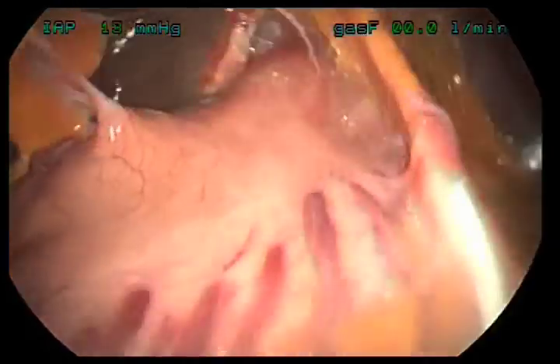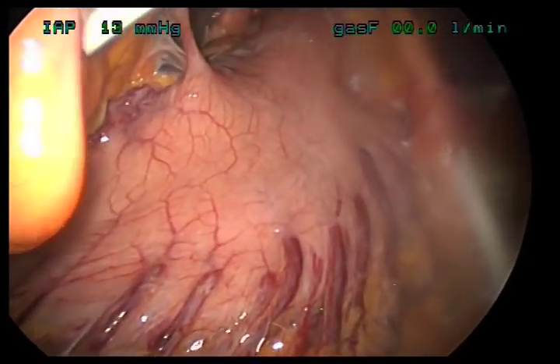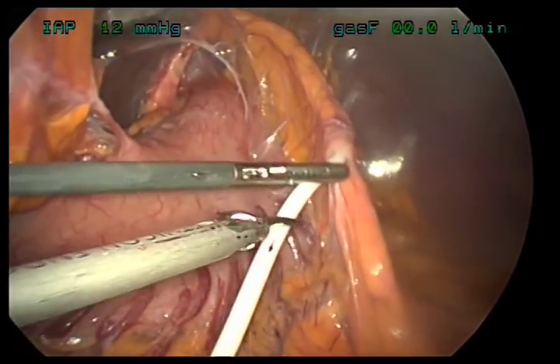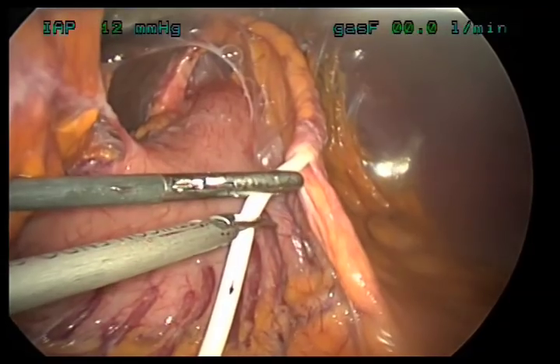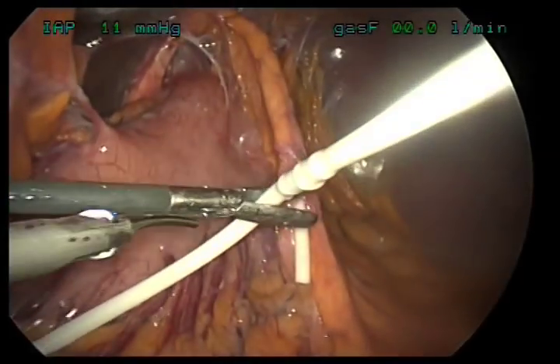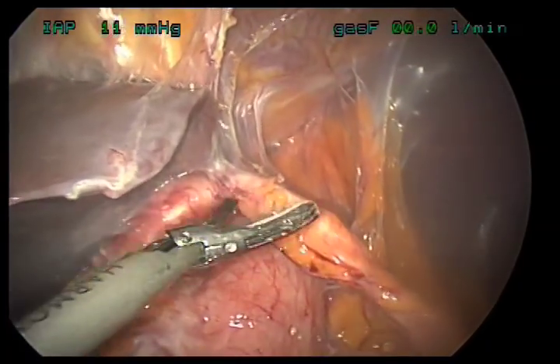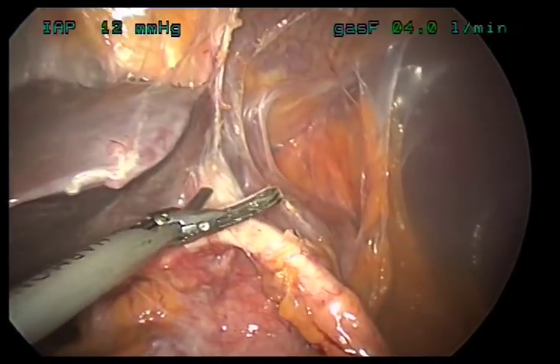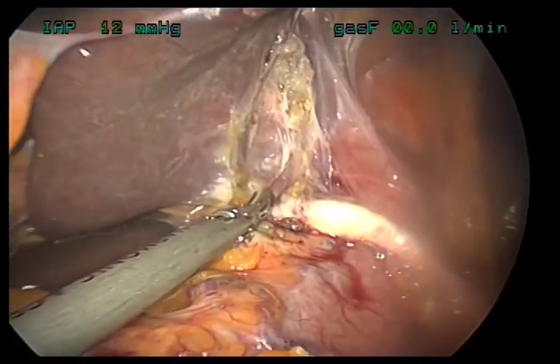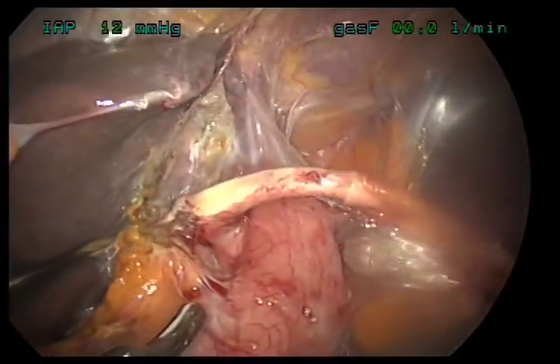The first thing that impresses you as you look around the abdominal cavity is the large amount of scar tissue left over from the previous operations. In order to remove the scar tissue, the first step is to remove the lap band. Here we're cutting across the lap band tubing attached to the laparoscopic band port. Now we're going to take down the scar tissue between the liver on the left and the lap band underneath, using a special device called the harmonic scalpel, which cuts and stops bleeding all at once.